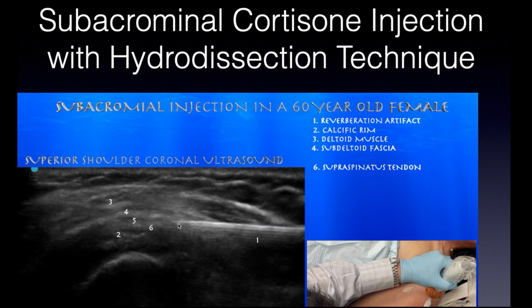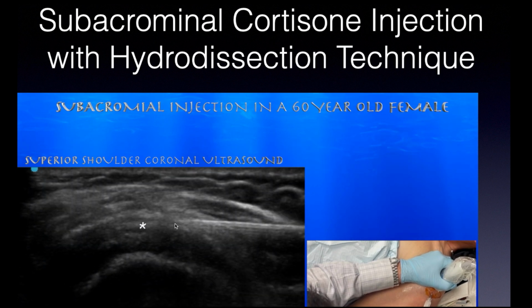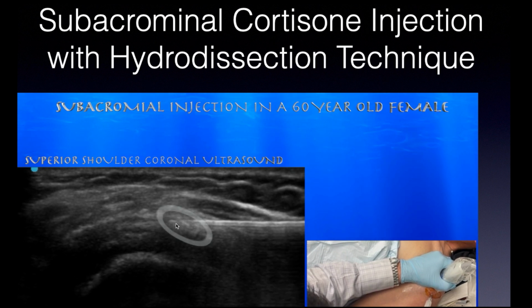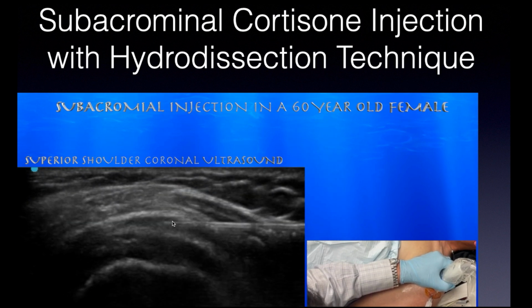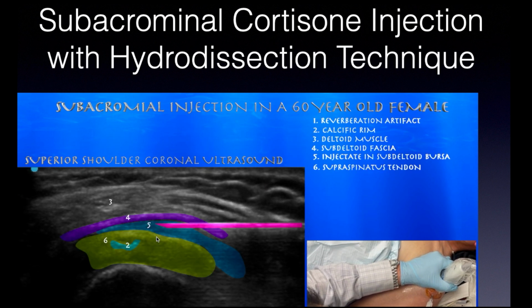Once you get the needle in, you don't have to panic or try to get it to target quickly. Always take your time when you do these procedures. I would inject slowly and see how the patient reacts. If the patient has a ton of pain, maybe you're actually in the tendon or in the muscle, but if they really react, you're probably in the tendon.